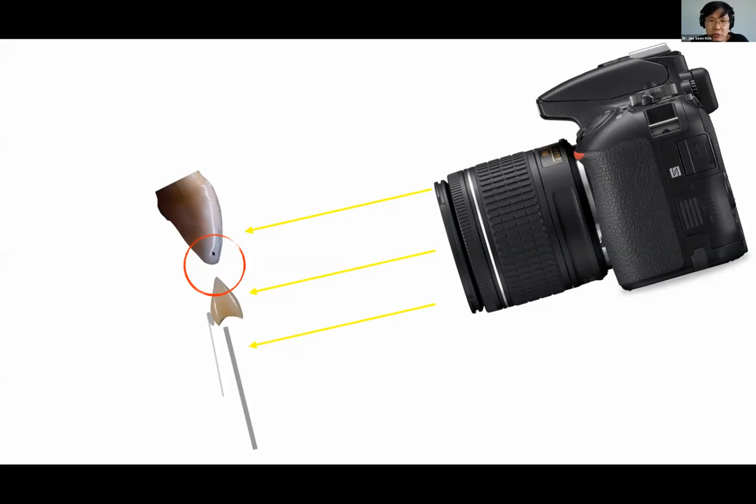But years ago, when I was doing my residency, a very talented ceramist, Hiro Tokutumi, who practices in Boston, came and gave us a lecture about shade taking, and he always asked us to leave at least a millimeter of space between the tooth and the shade guide.